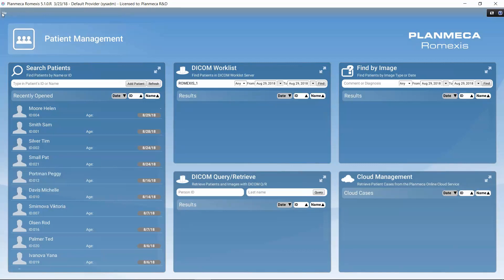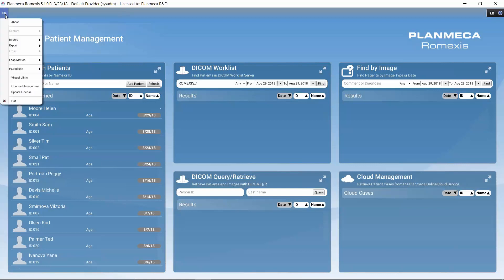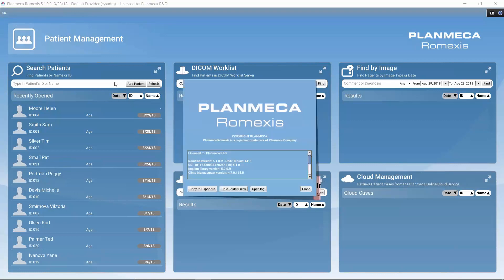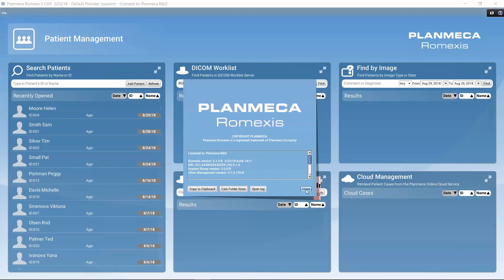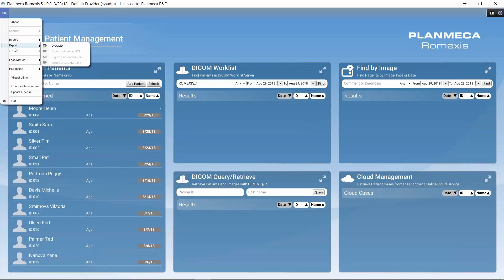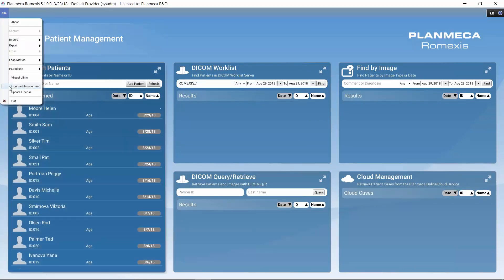We can find further information in the file menu. If we open it, we can open the About section to see further information about the version numbers. We can also find information about the license we are currently using in Romexis.